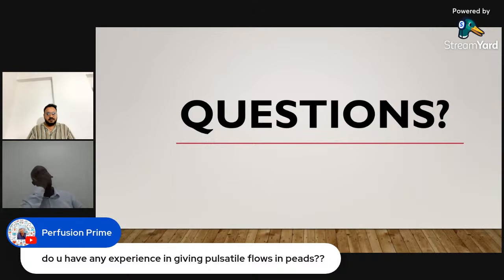Do you have any experience in giving pulsatile flow in pediatrics? We don't use pulsatile flow. We use non-pulsatile.